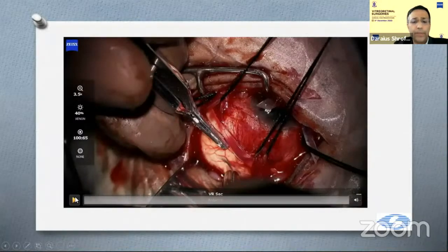So at that time we could not image the patient. So we were wondering how to close the hole because closing the hole was essential for settling the detachment also. So you'd just like to have a look at the surgery.